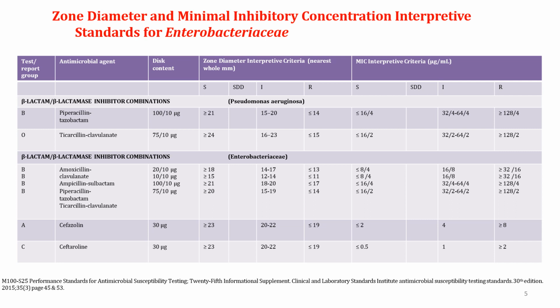If the MIC of the E. coli would have been 16, which is more than the resistant breakpoint, that is 8, I would interpret that MIC of 16 as resistant. If the MIC would have been 4, I would have interpreted it as intermediate. So this is how the breakpoint chart can be used to interpret the MIC whether it is sensitive, intermediate, or resistant. So when we get a microbiology report, it is not the MIC, but it is the breakpoint that helps us to understand whether it is susceptible, intermediate, or resistant.